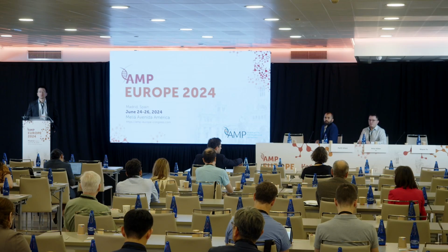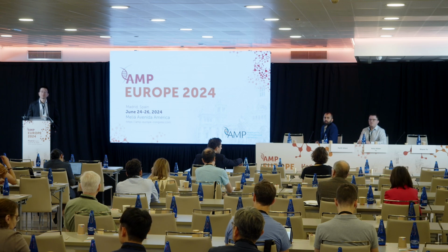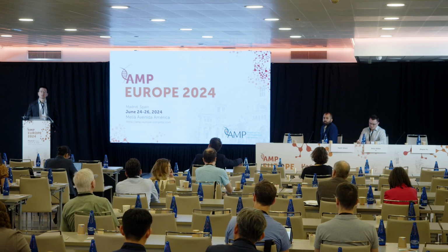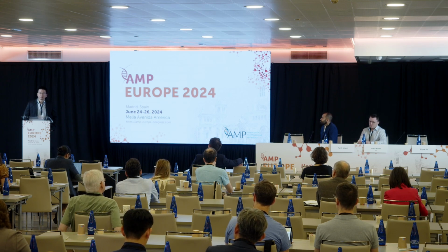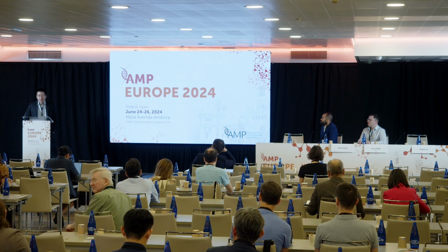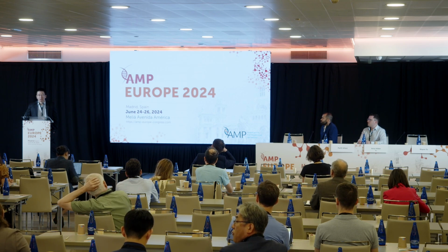Hi, just a small practical question. What would be the turnaround time from sample receipt to actual analysis and receipt of results? Generally, since sequencing, it takes about 2 to 3 days. It could be about 2 days of wet lab and probably 1 day of analysis. It could take about a week, actually.